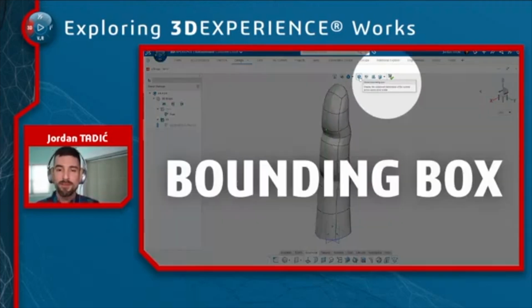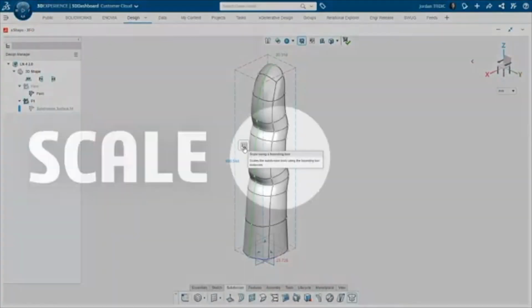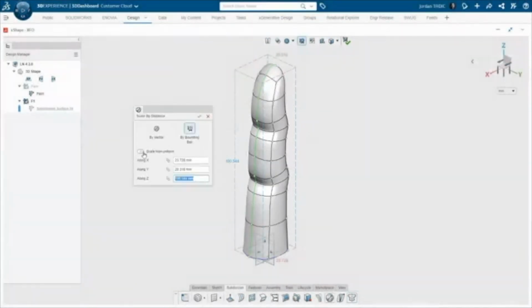Wow. But what about the size as well? You mentioned dimensionally or parametrically controlling something. Right. Yeah, how are you going to do that? In this case, we could turn on the bounding box. The bounding box is cool because it shows a live measurement of the total height, width, and depth of the model. I could tweak the model and those measurements would update live. But even better than that, I could click on any one of those dimensions and then from the context toolbar, activate the scale command, which then allows me to non-uniformly, if I choose, enter a precise value for each one of those dimensions. So 22 by 22 by 100.